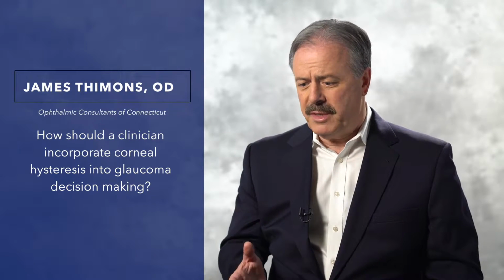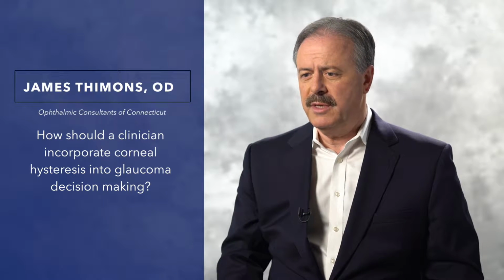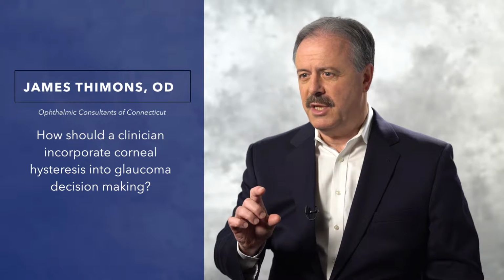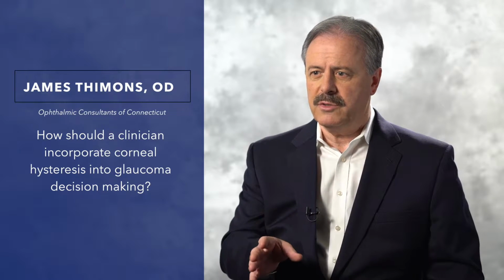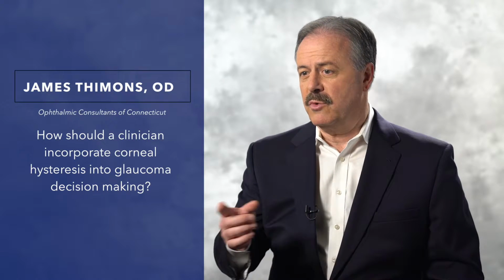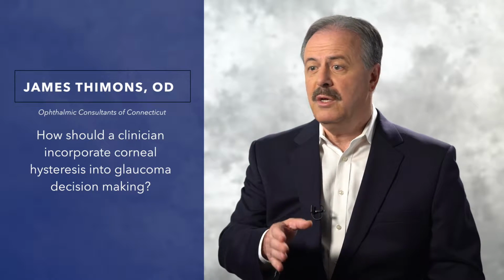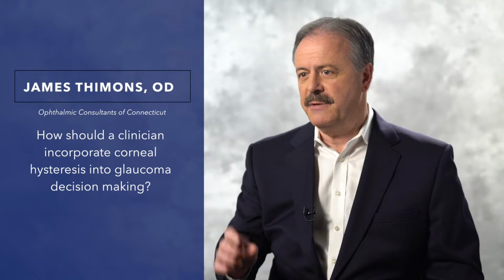On the glaucoma suspect side, patients who are potentially drifting or moving towards glaucoma, it gives me a window of opportunity to understand future behavior. And patients who are glaucoma suspects with lower hysteresis are going to be watched more frequently. It may have been I've seen them once a year in the past, now I might see them twice, or maybe even 3 times a year, understanding that their risk rate is that high.